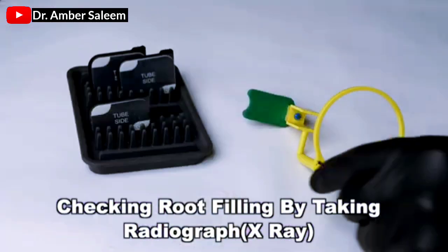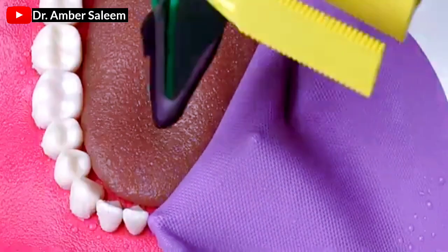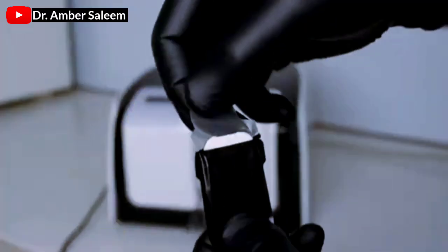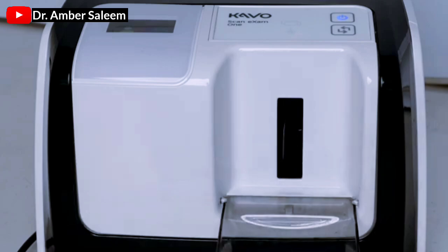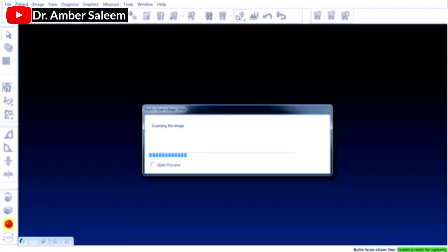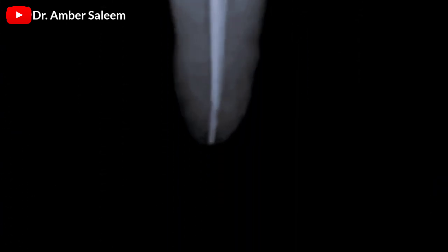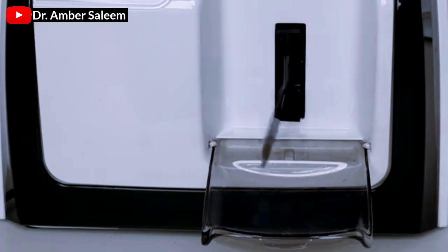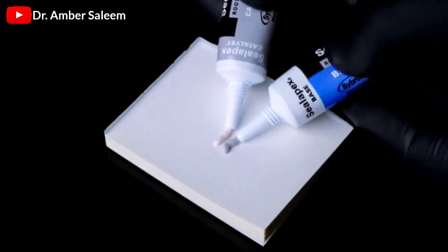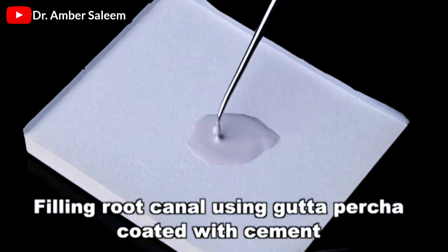Checking root filling by taking radiograph X-ray. Filling root canal using gutta percha coated with cement.